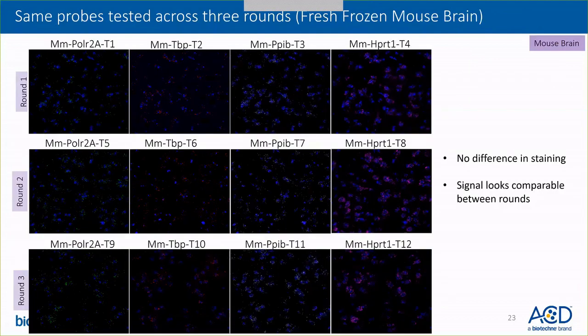I'd like to move into a fuller comparison between various rounds. Here we are showing four target detection in round one, round two, and round three — the same set of four targets detected on three different tissue sections, each in a different round. There is no difference in staining and the signal looks comparable between rounds. This points to the fact that there is absolutely no sensitivity issue with the assay. We just recommend detecting the lowest expressor in round one for optimal assay design and inter-assay comparability.